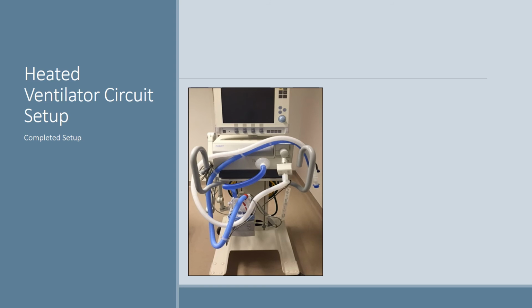Here you'll see a completed setup with all the pieces and parts that we've just connected. All the additional pieces and parts that you'll be needing, you can connect after this setup is complete, depending on your patient population and what you'll be using the circuit for.